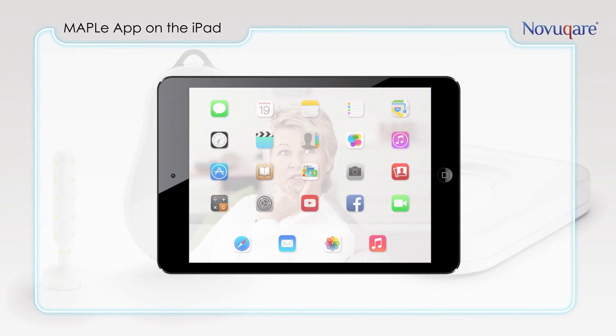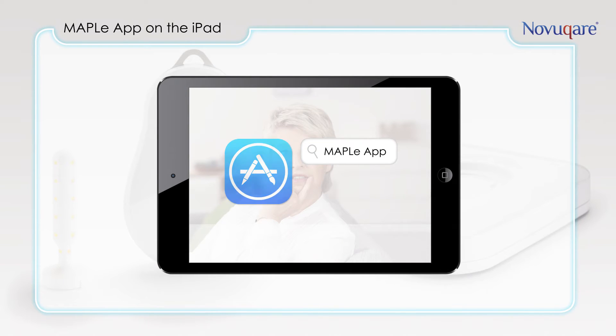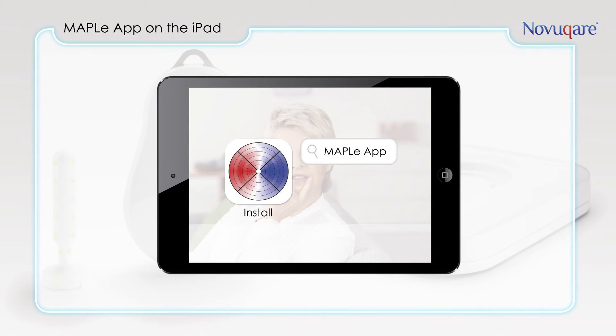The brain of the system is the Maple app on an iPad. You can download the app in the App Store. With the Maple app you control the Maple system and perform your diagnosis and treatment.